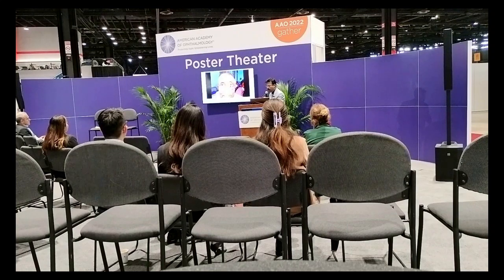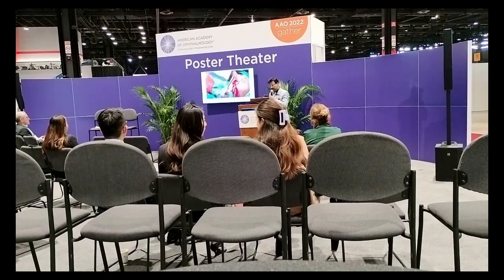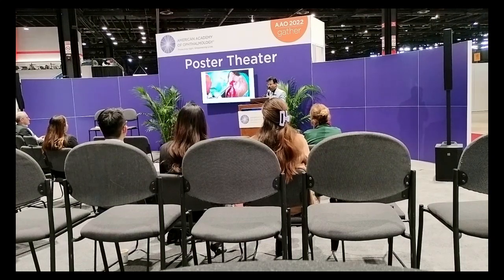The skin muscle complex is expanded for 3 days. On the 4th day, we deflate the balloon. Once the balloon is deflated, we instantly do dissection of the tumor, almost 100% created defect. It is not possible by a conventional rotational flap. As the tissue is expanded, we take advantage of this relaxed tissue.